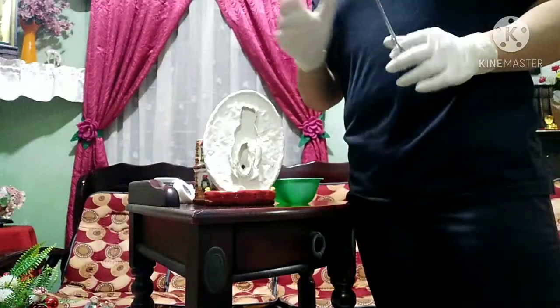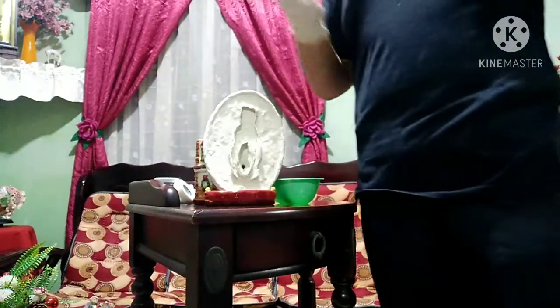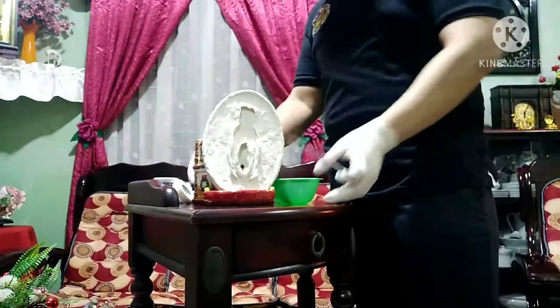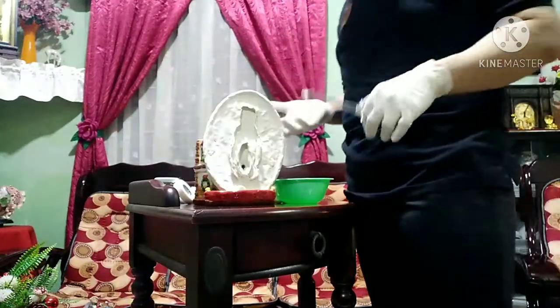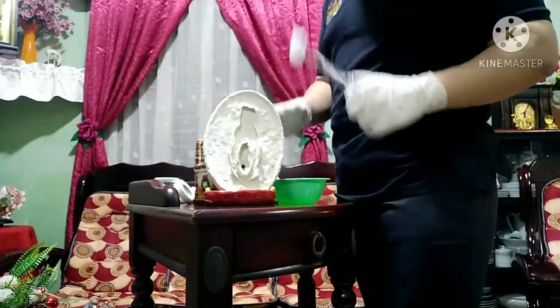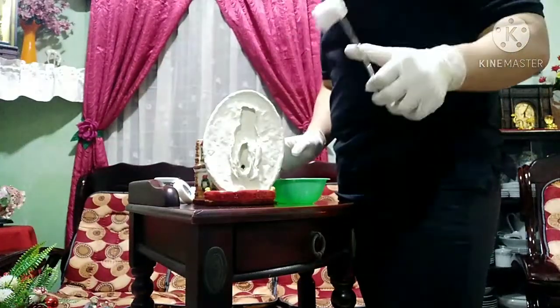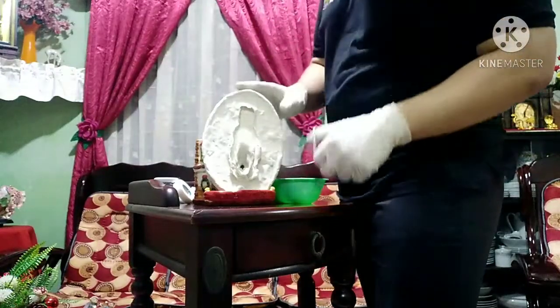Number 15, cleanse the labia from front downward to the anus. Make sure that the cotton balls are discarded after each use. After that, that is our step 15. Again, the same, to the anus.